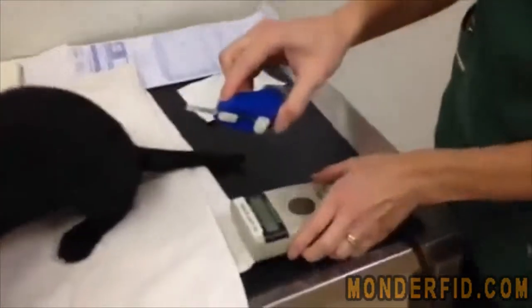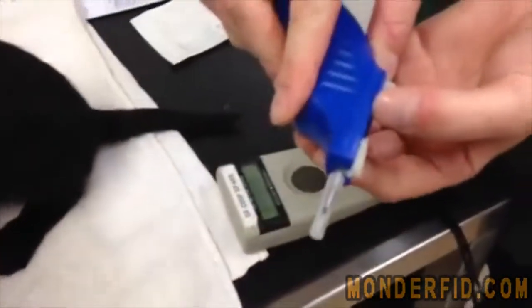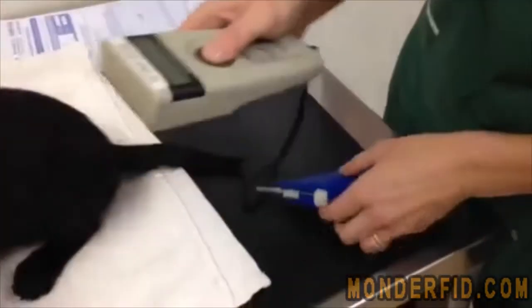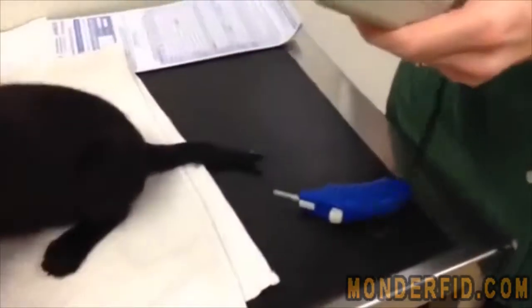This is the inserter with the needle — it's a rather large needle. Before you start, scan the chip and match it with the barcode on the back of the packet to make sure it's the correct chip.